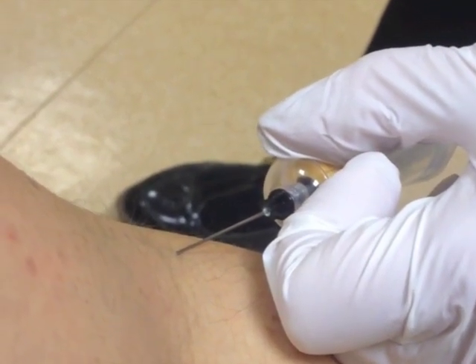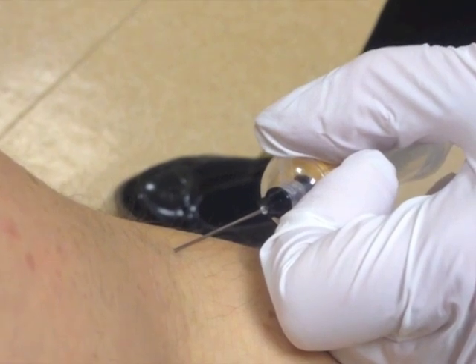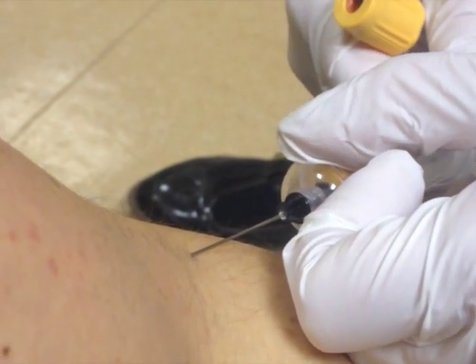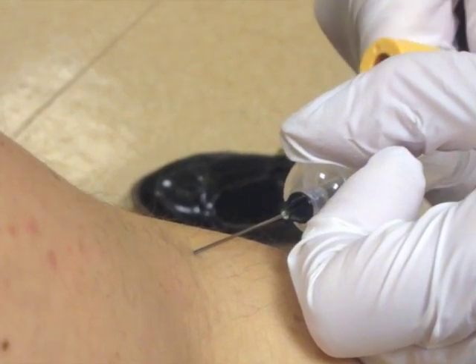This test you can get from your GP — it's absolutely free of charge to do so. In the UK it's not really recommended until you're over 40. You can see the second vial going on there, and one of those would be for the liver function test.